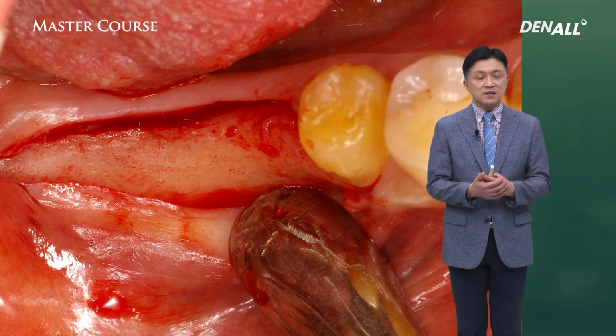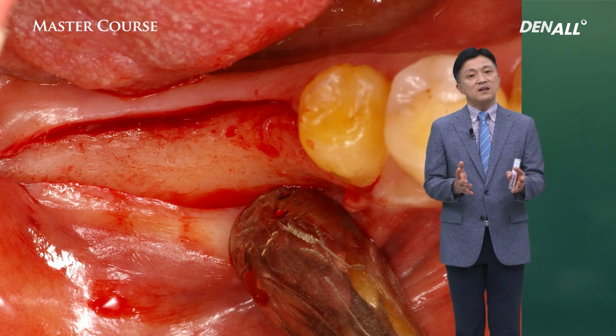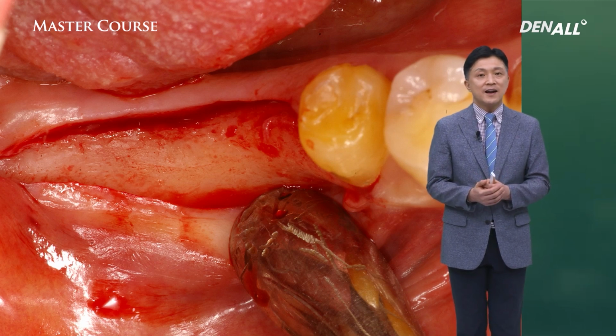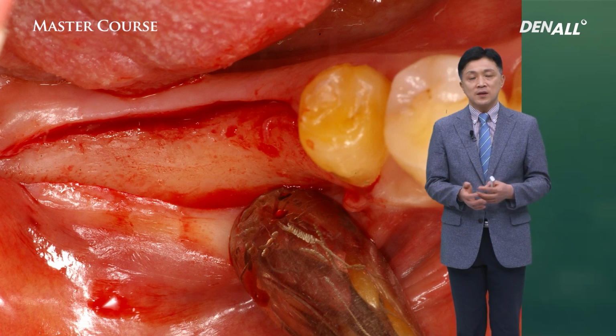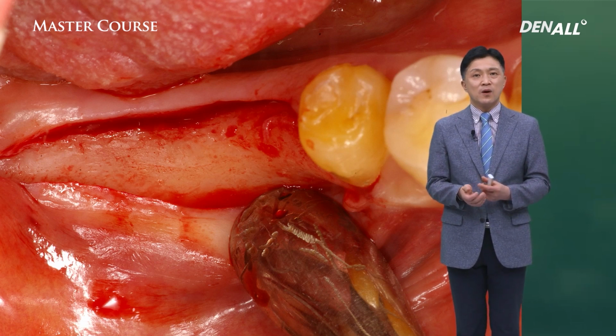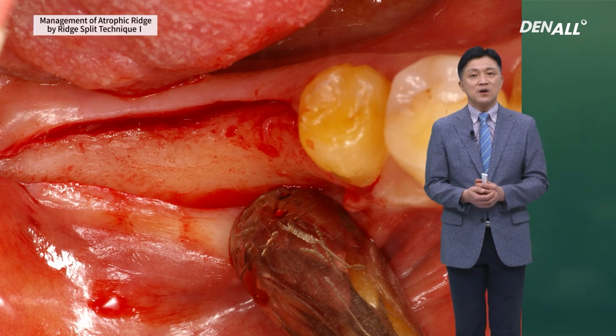If a long time has elapsed since extraction, you can see horizontal resorption, especially in the buccal area. If this worsens, you come across a knife edge ridge. There are many difficulties in placing an implant in such a thin ridge, and there can be many difficulties in securing long-term stability of the implant.